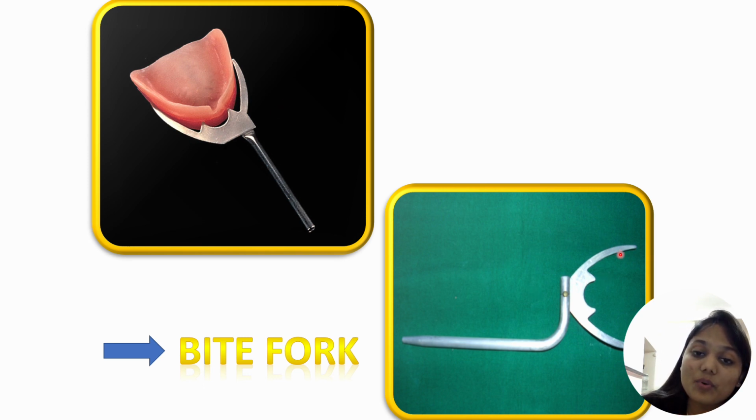Now this bite fork is for the edentulous patient, not for the dentulous. For dentulous patients we have another bite fork. Now this rod or stem helps us while joining the U-shaped frame with the locking device and frame. This bite fork should be placed 2 to 3 mm occlusal to the rims which have been fabricated, and it should be done after taking a tentative vertical jaw relation.